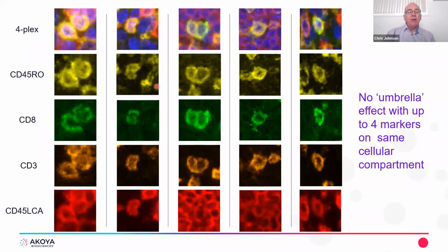Getting that correct means that you can co-localize some staining reactions even within a single cell, so that you don't get one dye necessarily overshadowing another one. The balance of the colors are actually quite good.